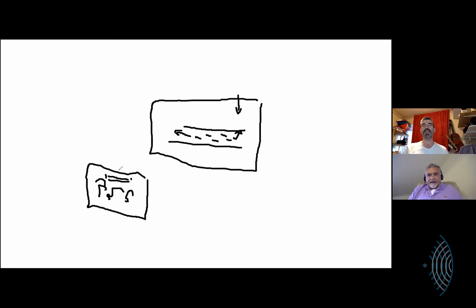If you have the sensitivity turned up so that you can pick up this horizontal movement, then you get lots of noise from all the micro movements in the hand and the probe and everything else. And so you get lots of noise in the picture.